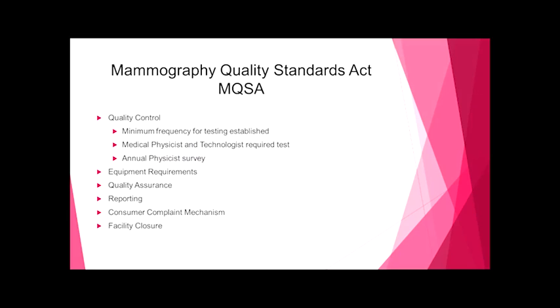Equipment requirements, and then quality assurance, and that's painted with a broad brush, but it's actually where we are in some of the things that we're going to be talking about, especially when we talk about the new EQUIP initiatives, where they have had things in quality assurance outlined under MQSA that were recommended, and in some cases strongly recommended.